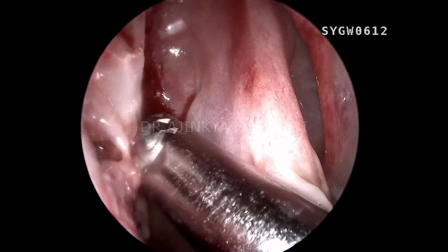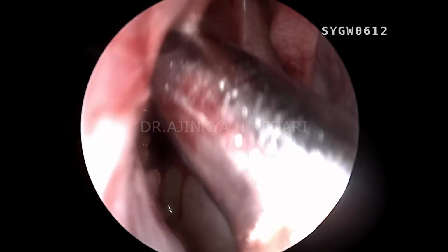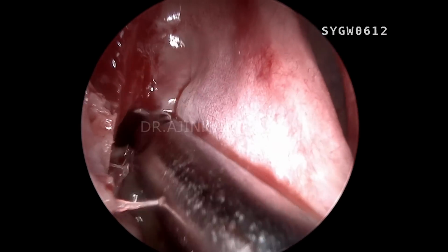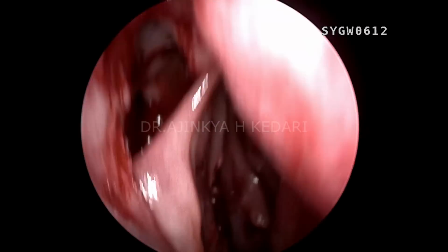Make sure you don't damage the lower half of the sphenoid ostium, because you may injure the sphenopalatine branch for the Hadad flap, which we are going to harvest towards the end of the surgery. So you can see that is the sphenoid sinus opening, that's the natural ostia.